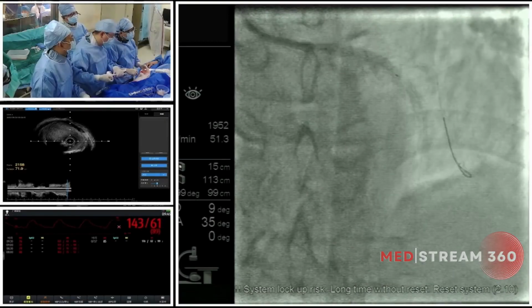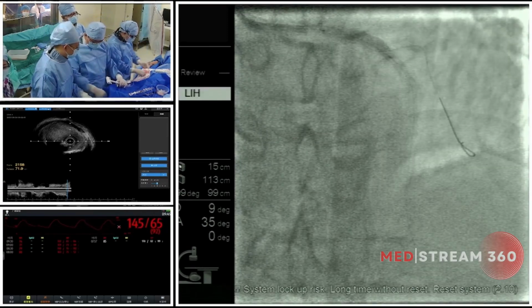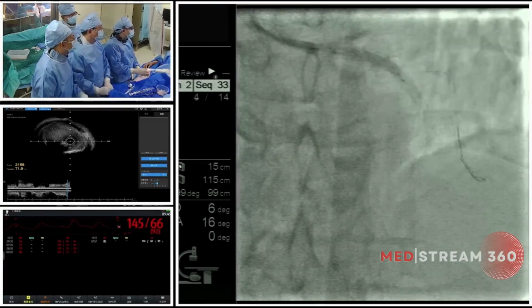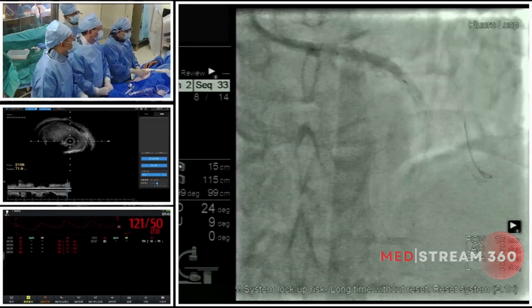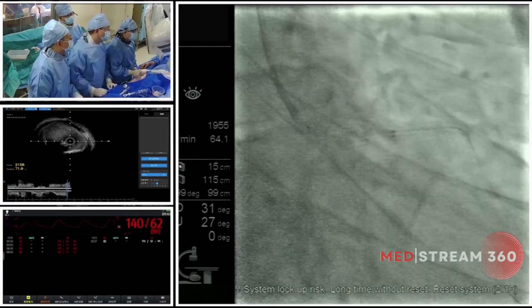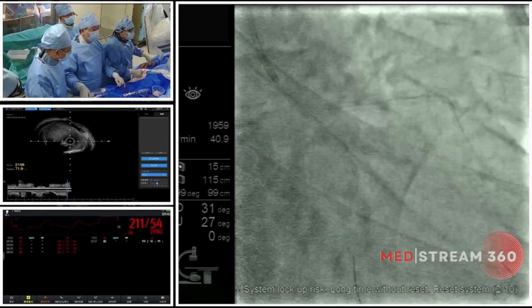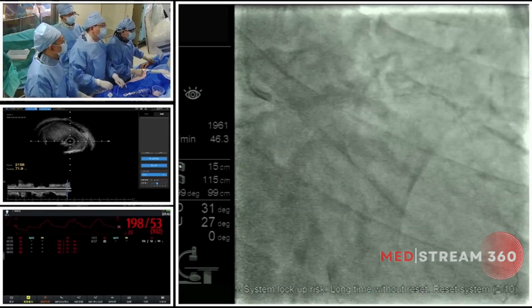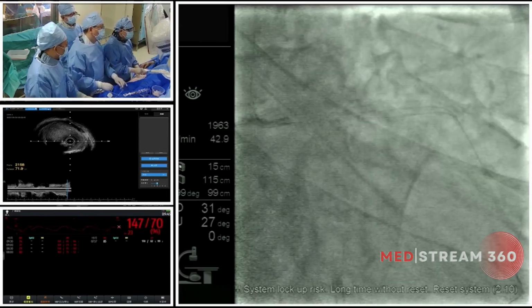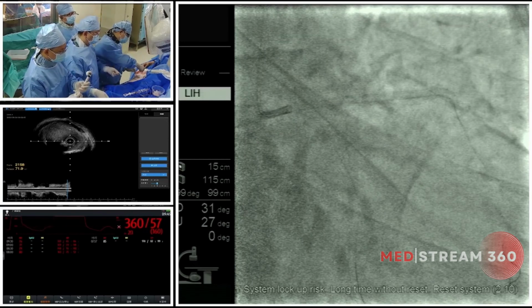As we all know, rota has a debulking effect on calcification of all kinds of plaques, but IVL just makes some fractures of the calcification, not of the normal vessel or the lipid plaque. So if we want a larger acute lumen gain, we should choose rota first.